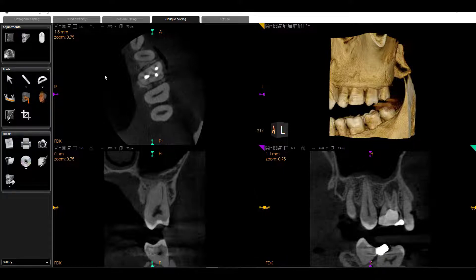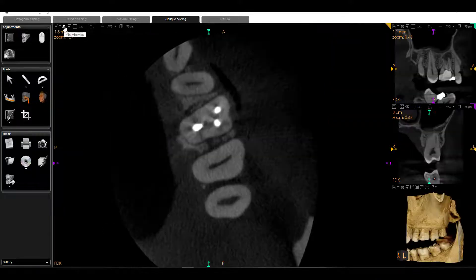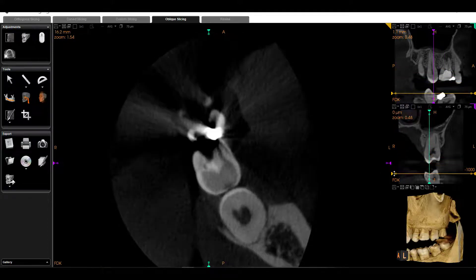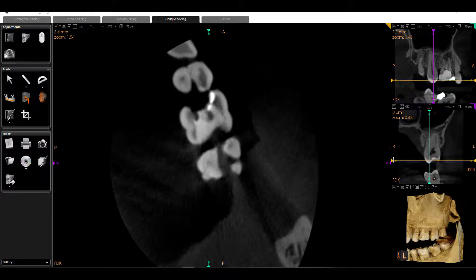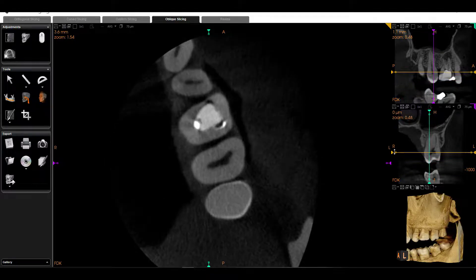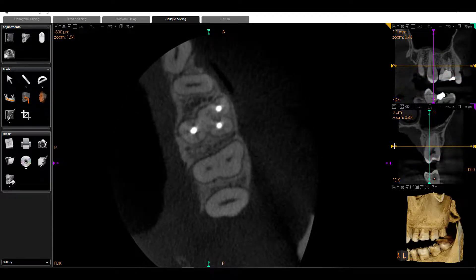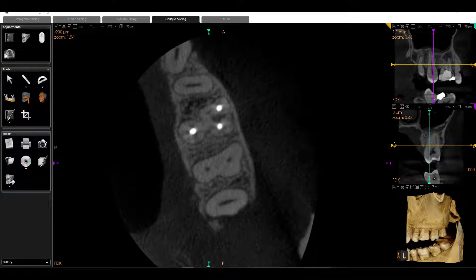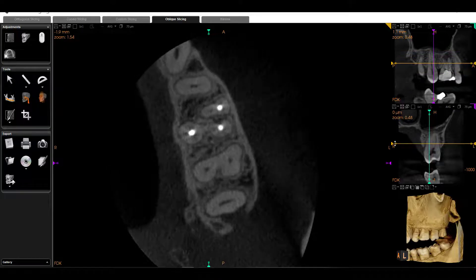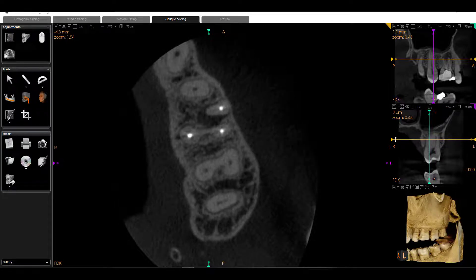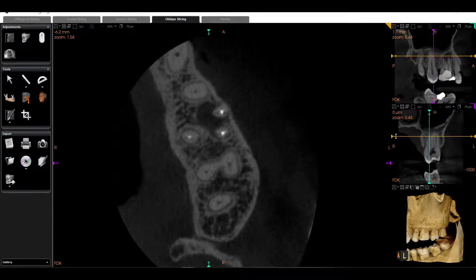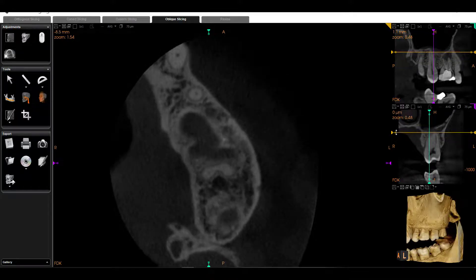So what I'm going to first do is maximize our axial slice. I'm going to grab my yellow movement handle, and I'm just going to begin coronally and slice apically. We can identify the treated canals, we can identify an untreated canal. We're going to keep slicing apically, and we can begin to see a low-density lesion.